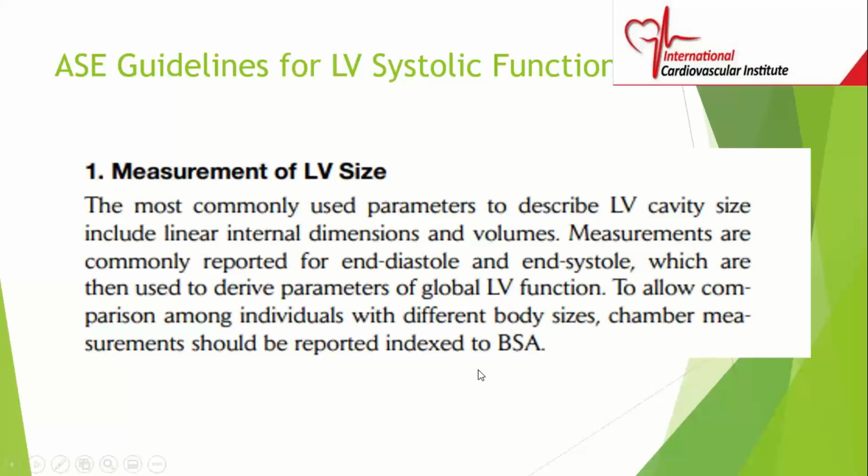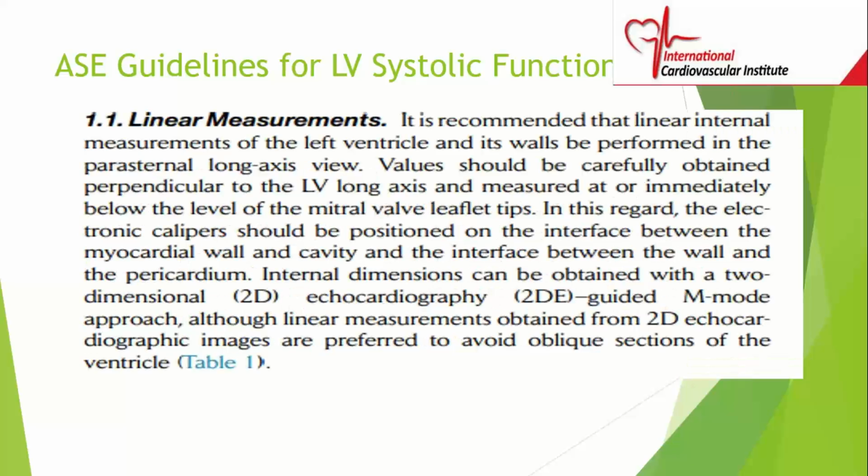We index a lot of our measurements. As a matter of fact, in this current report, a lot of measurements are indexed. When you index a measurement, you divide by the body surface area. So let's look at some of the linear measurements. It is recommended that linear internal measurements of the left ventricle and its walls be performed in the parasternal long axis view.